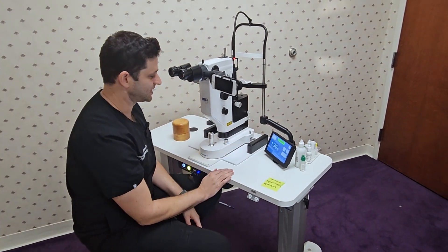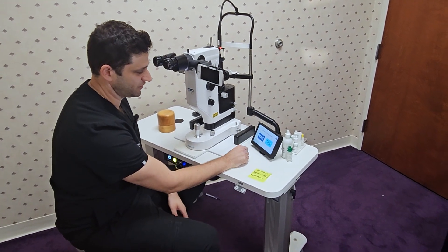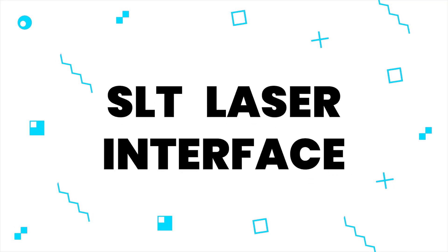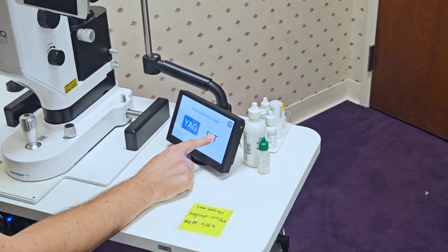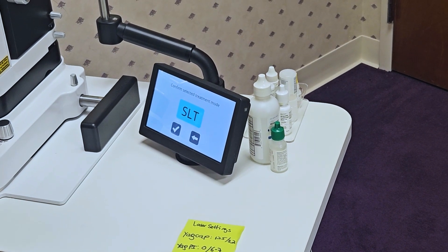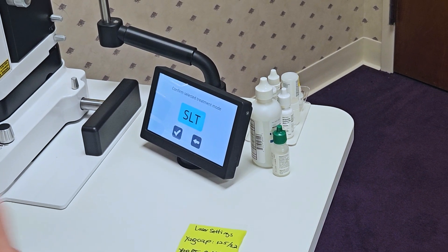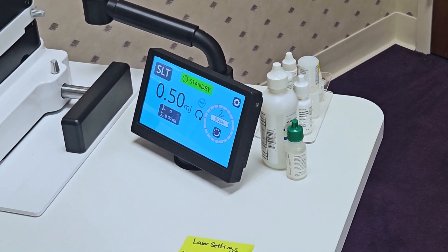That's really about it for the YAG setting — an excellent machine for YAG. SLT is also equally intuitive. Holding that down will enable the SLT. You can hear it change into SLT mode. It only takes about five to ten seconds for it to switch, so it's really not bad at all.